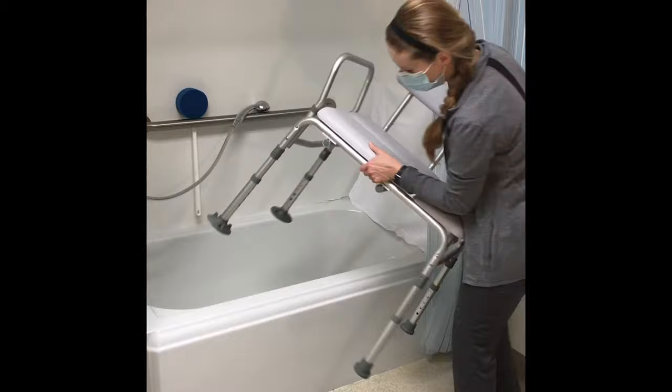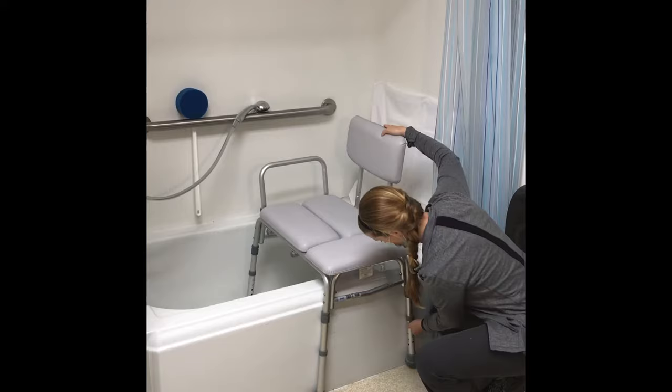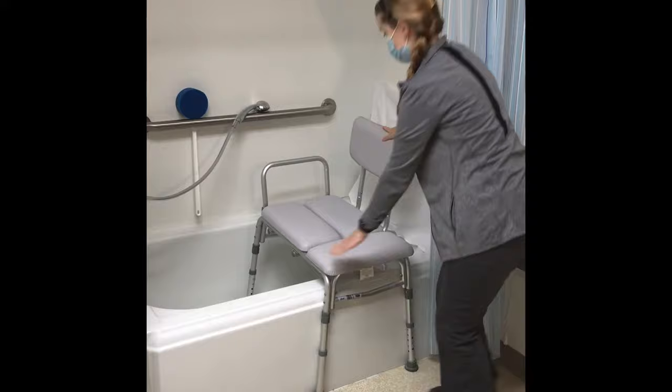Place your tub transfer bench with two legs in the tub and two legs on the outside of the tub, facing the shower head. Have your caregiver help you adjust the height of the legs so it fits safely over the side of your tub.